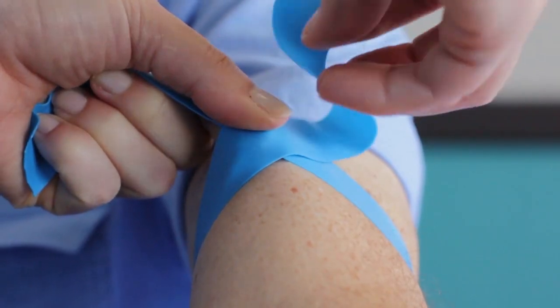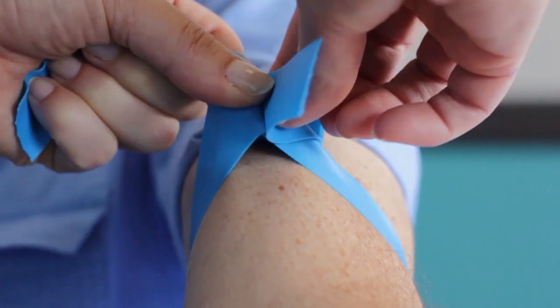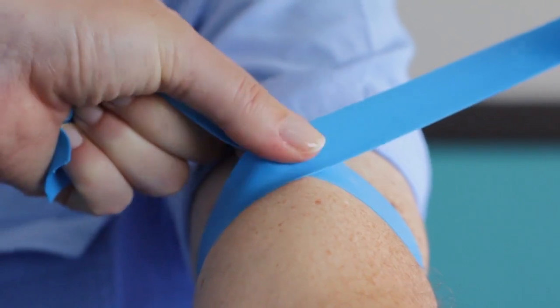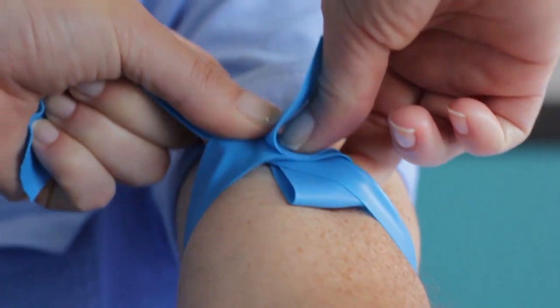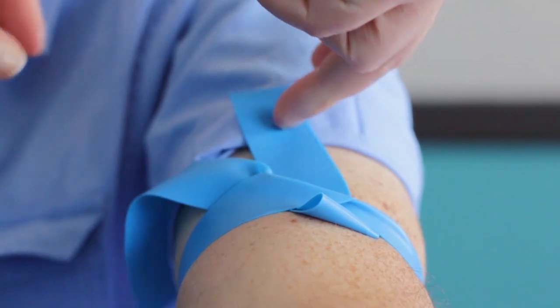Pull the ends upward to form an X. Fold the right end over on itself and pull both ends upward. However, pull the end on the right side somewhat tighter. Tuck the double-folded end halfway under the other left end, leaving a reasonably long free end pointing away from you.